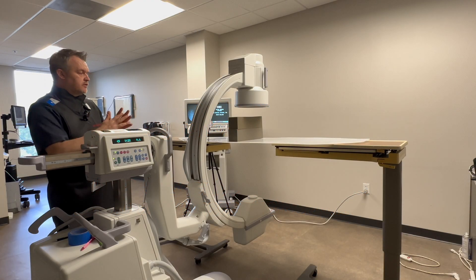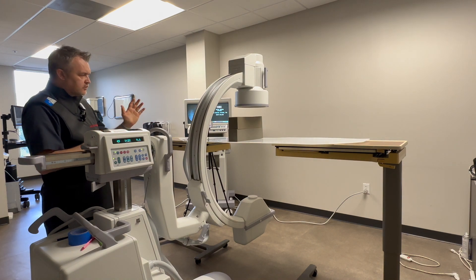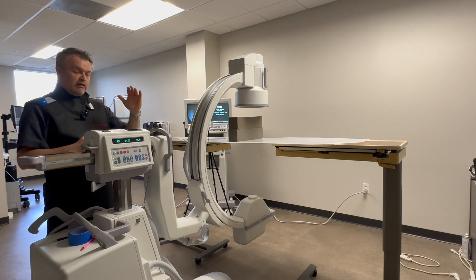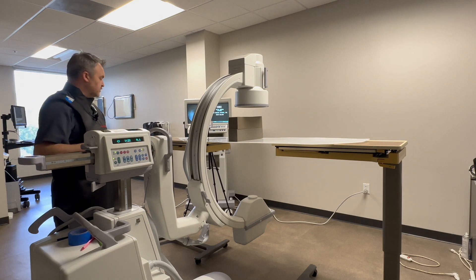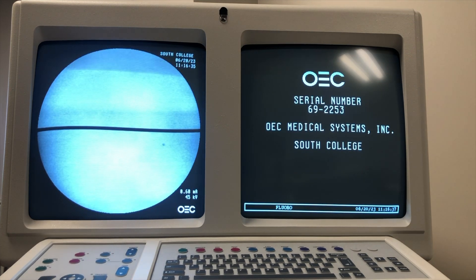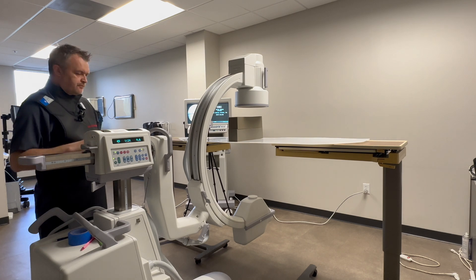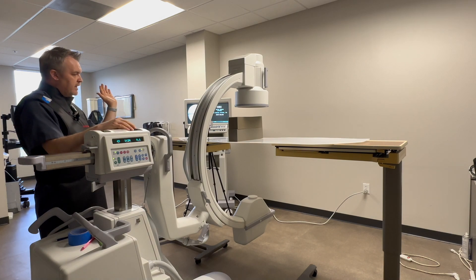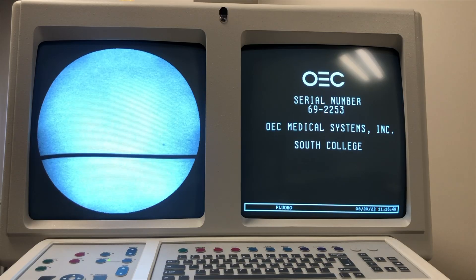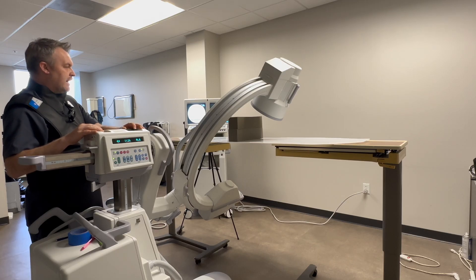Something I see quite a lot is when technologists are performing inlet-outlet or pelvic imaging on C-Arm, the anatomy drifts quite a lot from projection to projection. Here we have our AP, and you can see the wire is running essentially 9 to 3 across the screen. So when I go ahead and apply inlet tilt, and go live, you can see that the wire is travelling down the screen — so that's not ideal.